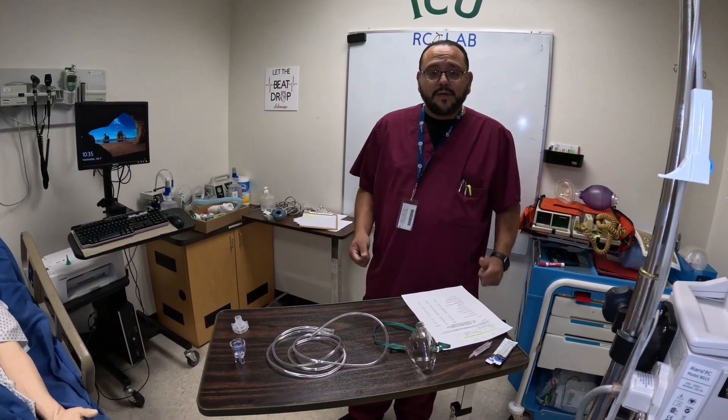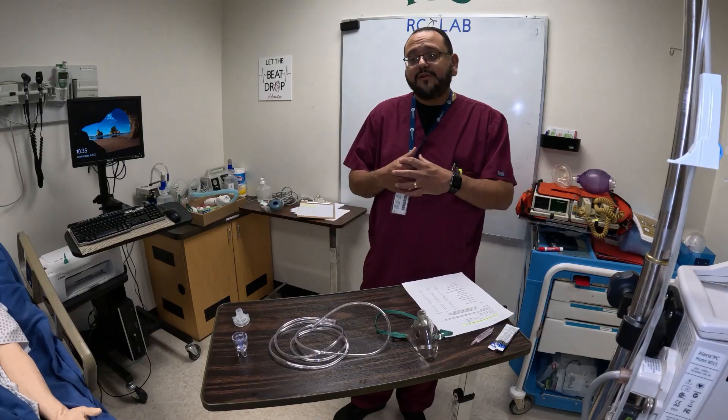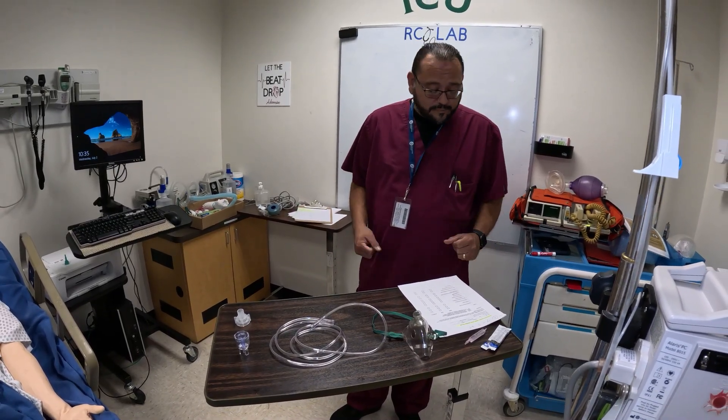We are going to do our competency for small volume nebulizer therapy. So of course, we need to check the patient's orders, make sure that we have an order for everything we're going to do, scan the patient's chart. We're going to have PPE on, so any type of gloves, gowns, masks — we're going to have all that on for this particular treatment.